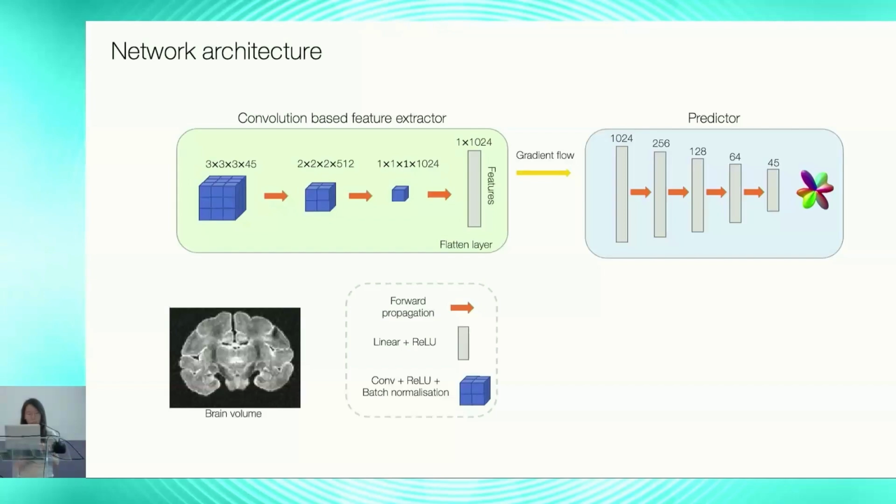To start with, here is a simplified network architecture. We take out blocks of the diffusion signals, because the fiber orientation is quite local, so we are doing it in a more local way. And then we process the data with the convolutional layer and the fully connected layer. We can aim to estimate the fiber orientations from the postmortem diffusion data.